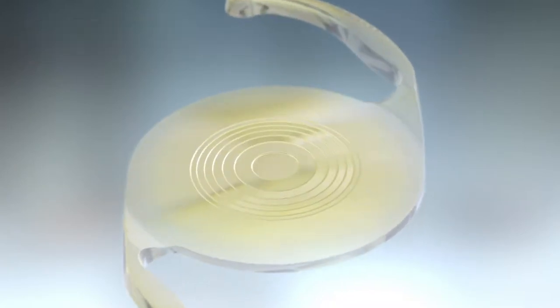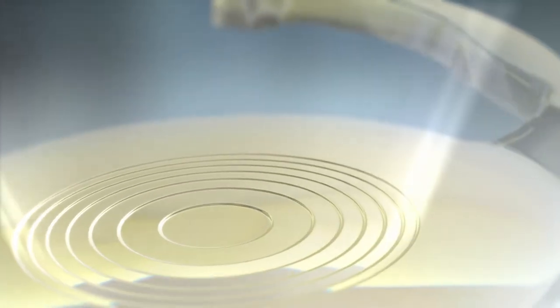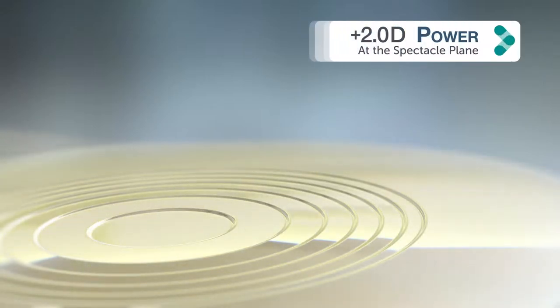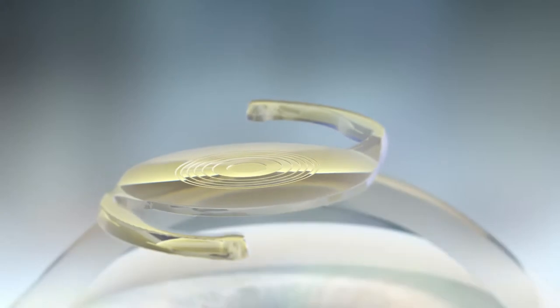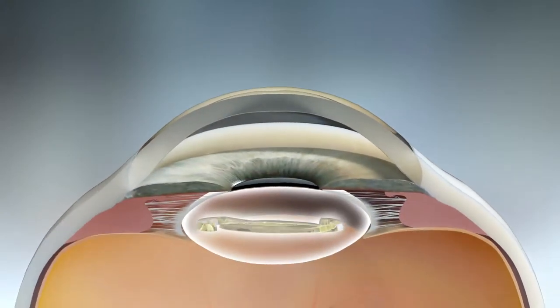Restore 2.5 accomplishes this with a seven-step proprietary apodized diffractive design for more efficient light management and heightened contrast sensitivity. The optimized number of steps provides an add power of two diopters at the spectacle plane. The central portion is entirely dedicated to distance vision and, unlike traditional multifocal IOLs, it directs a high percentage of light to the distance focal plane.